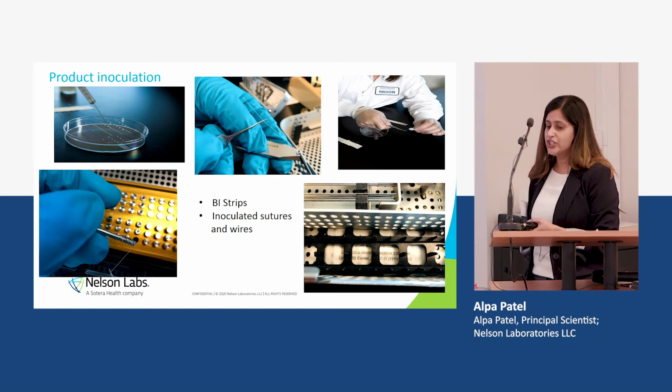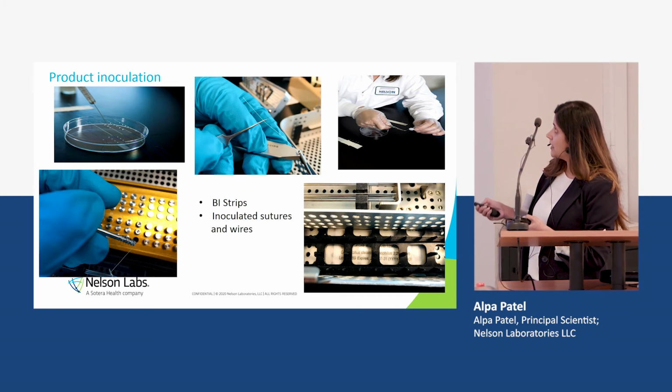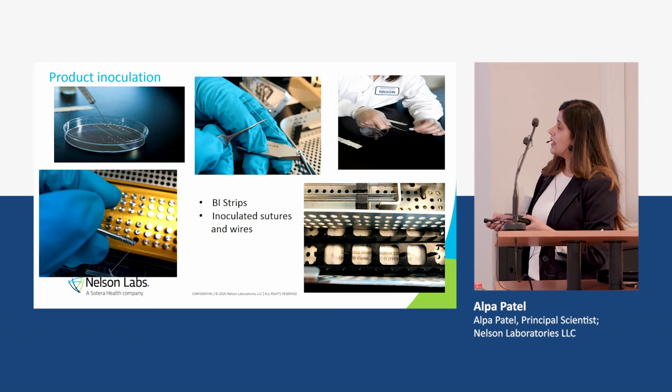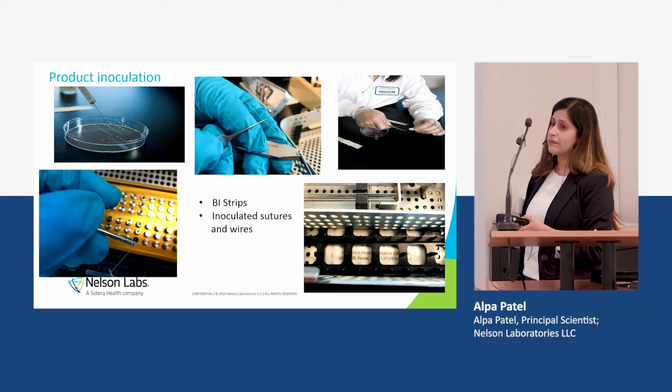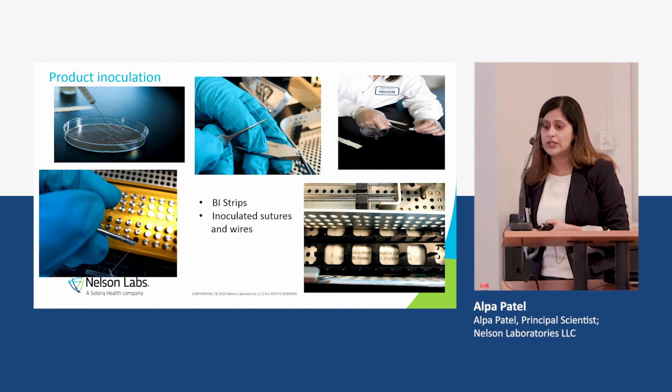For product inoculation, we're using BI strips. You can see down here that we've placed one underneath a caddy. We are inoculating with sutures and wires. And you see that we pulled up a little screw from here, put it in that, and then we'll put it back in there. So we are trying to find locations that would be most difficult to sterilize.